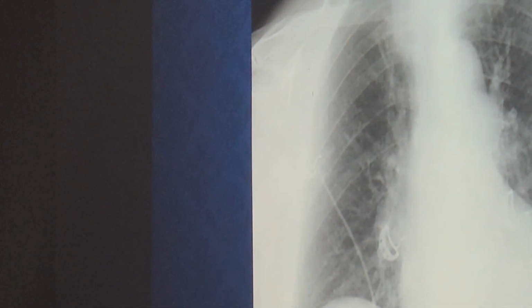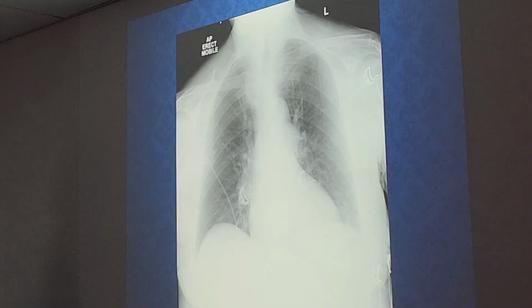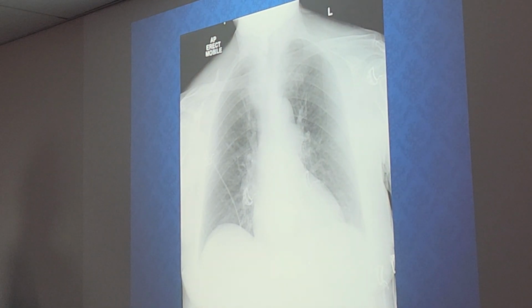The information that we see on Synapse, the extra information like kVp, mAs, S value, how is the image able to display that information? Where's that data stored? We talked about this back in PR. That additional data on an image, is that DICOM? DICOM, very good. The DICOM header is where the information is stored.